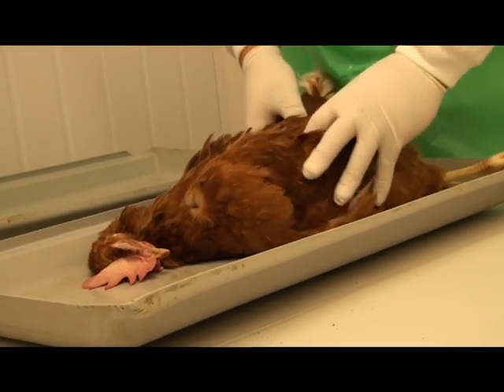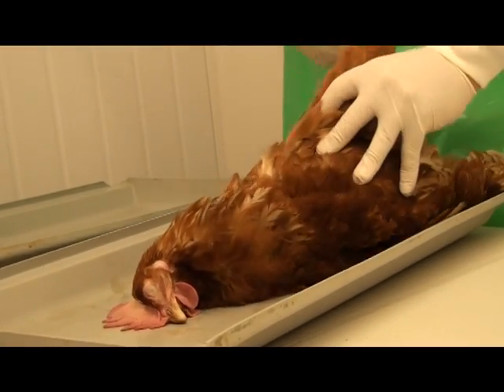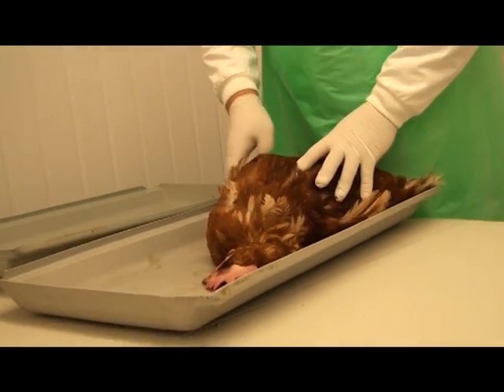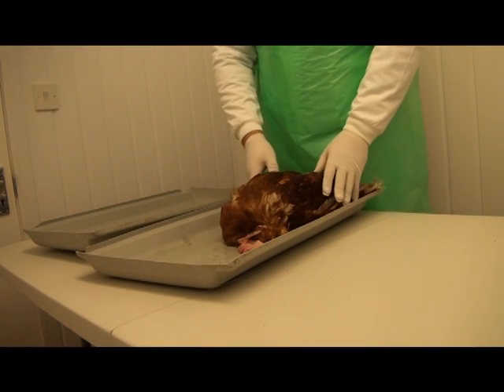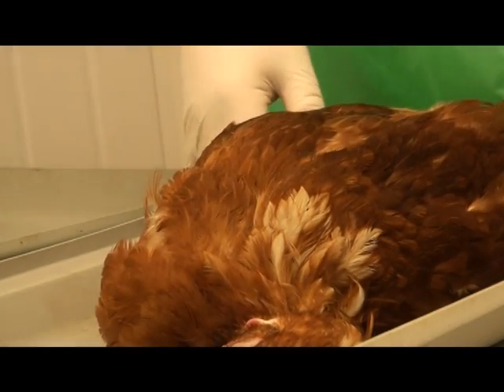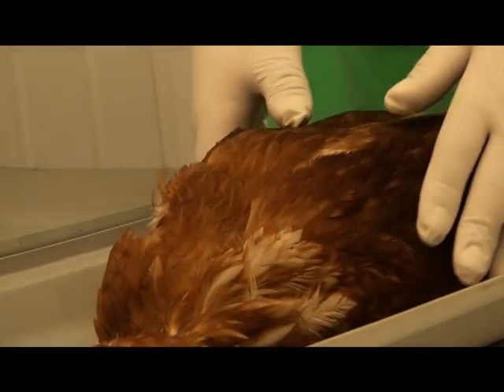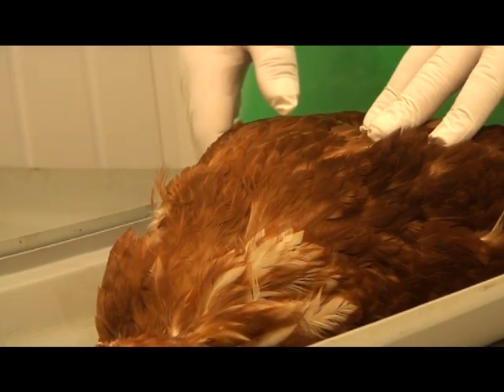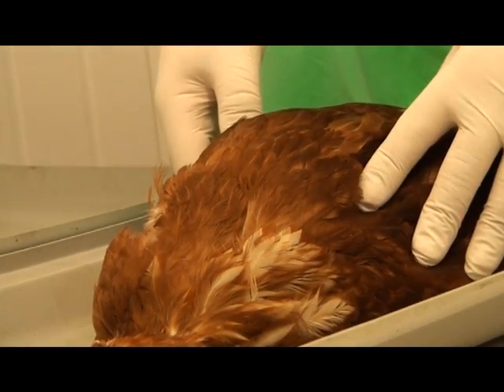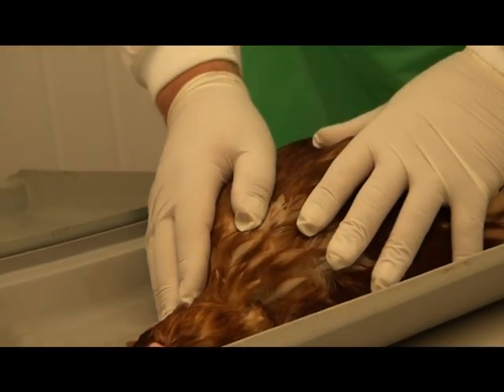First of all, I always look at the feathering of the bird and try and estimate the degree of feather cover. And in this bird, it's virtually 100%. The feathers there are to insulate and waterproof the bird and are therefore very, very important, especially during the winter period. If the bird loses its feather, it can make it very difficult for the flock to perform to its optimum. So lose the feather, lose the flock is a favourite phrase that we use. They have a very, very important function and they must remain.